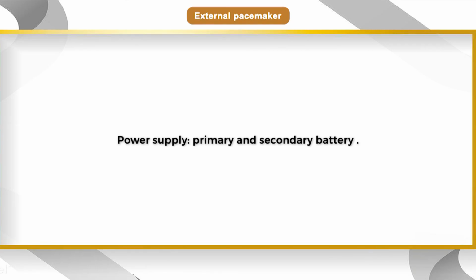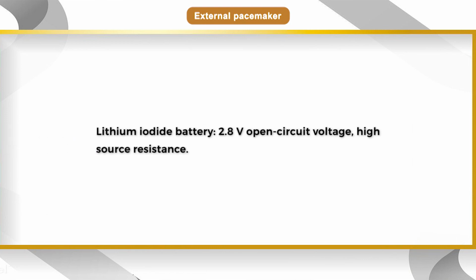Power supply is primary and secondary battery. The batteries are lithium iodide batteries and the voltage of the battery is 2.8 volt. Open circuit voltage and high source resistance.